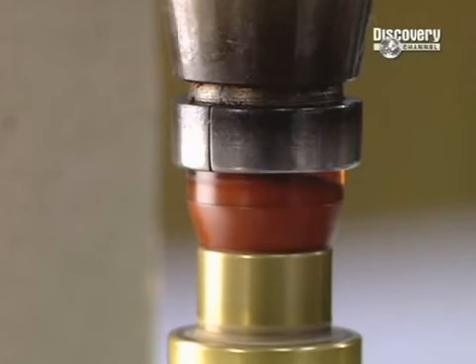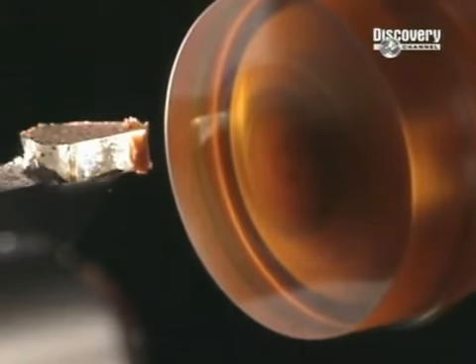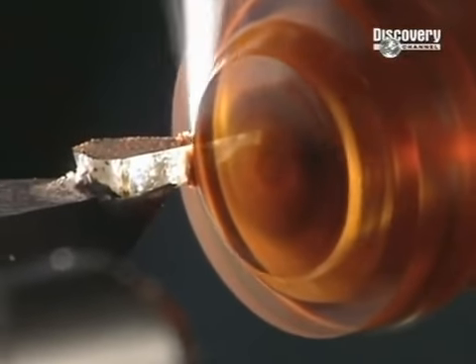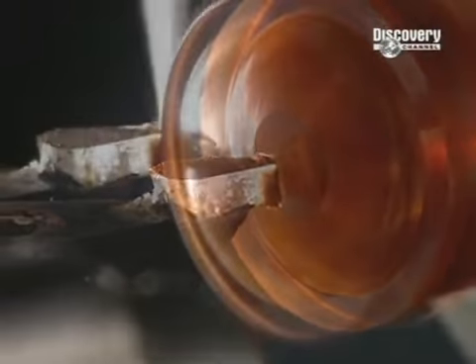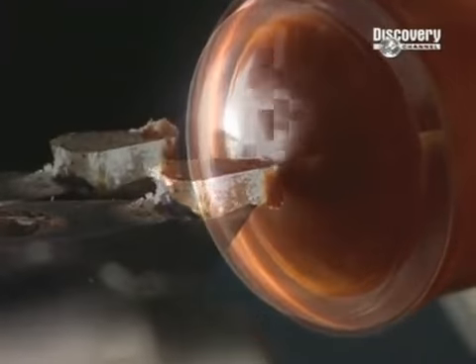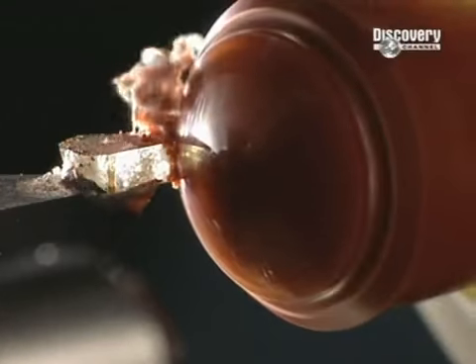The wax is moulded in just seconds. The outer diameter of the lens is now shaped as the computer-controlled arm effortlessly cuts away the excess polymer, and is then polished.